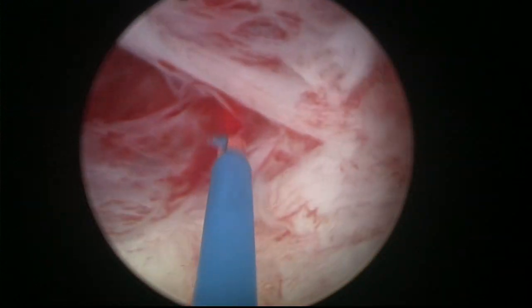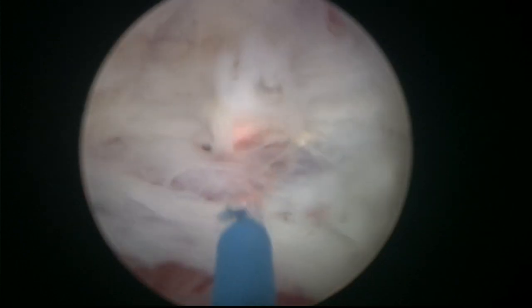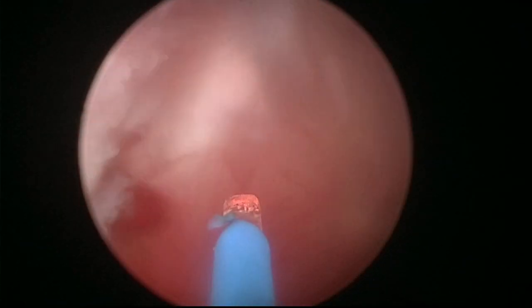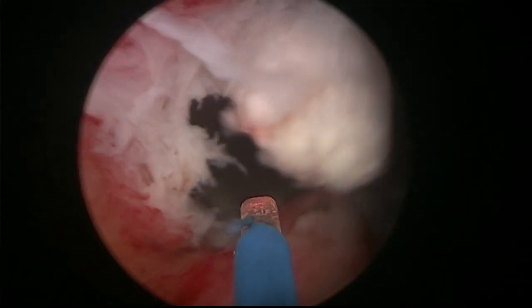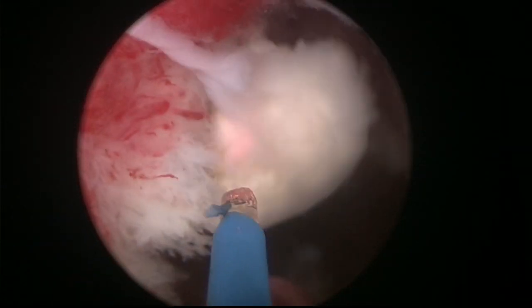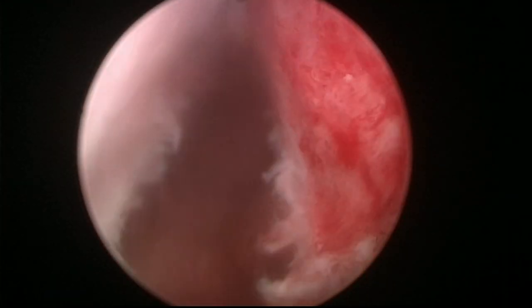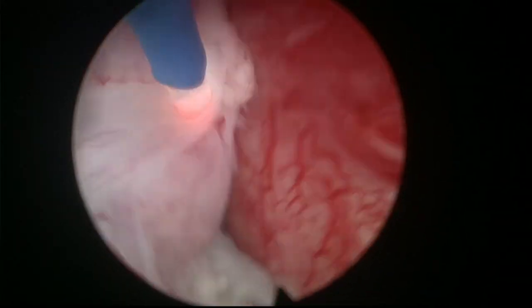We went a little bit into the capsule, but nothing to really worry about. Let's do some hemostasis — I think it's pretty good here. This is a small adenoma. The next step is going to be to go to the 12 o'clock area to do the 12 o'clock incision.